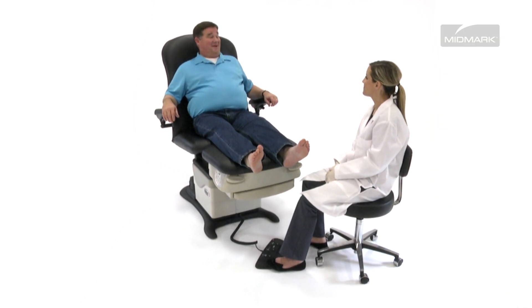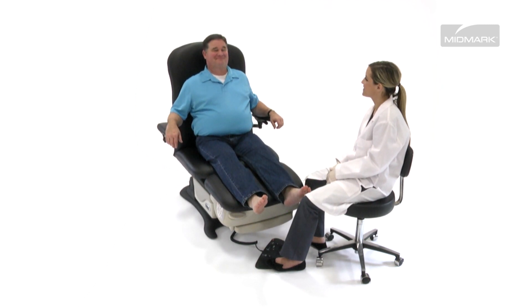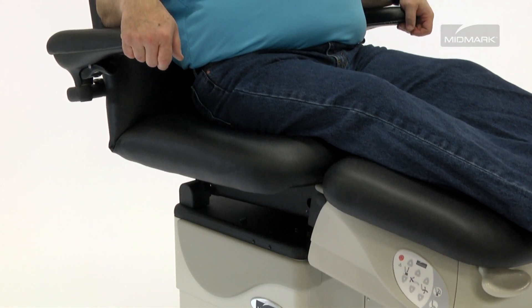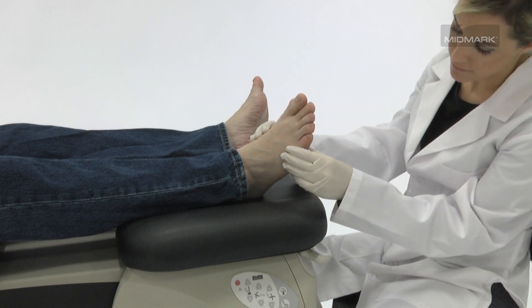Custom design actuators are designed to move your patients quickly into the proper position for exams and procedures, helping make you more efficient. Powered movement of the seat, back, and tilt gives you flexibility to position patients where you need them for better access and a clearer view of the lower extremities.